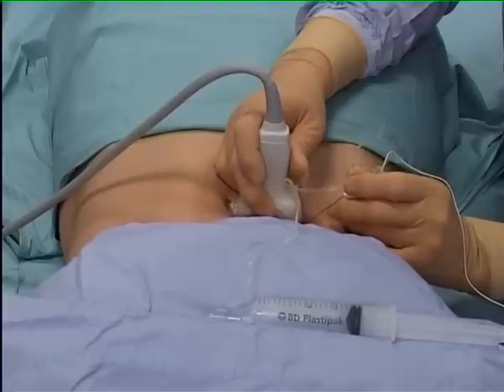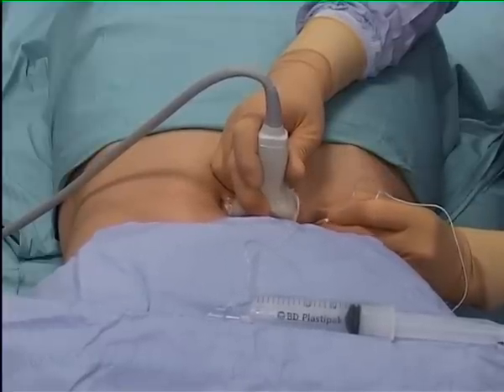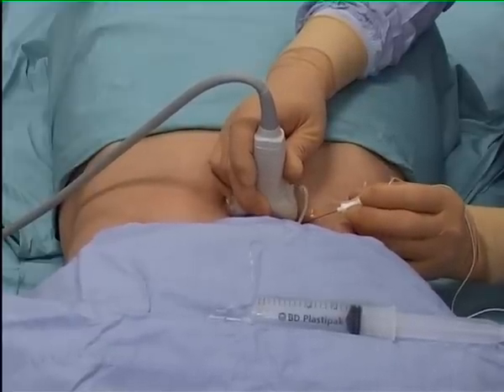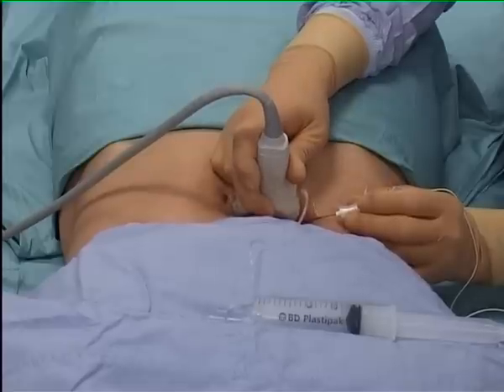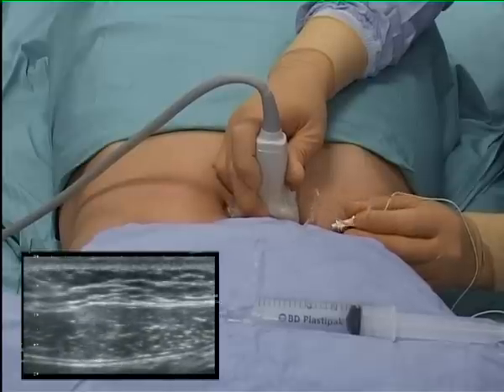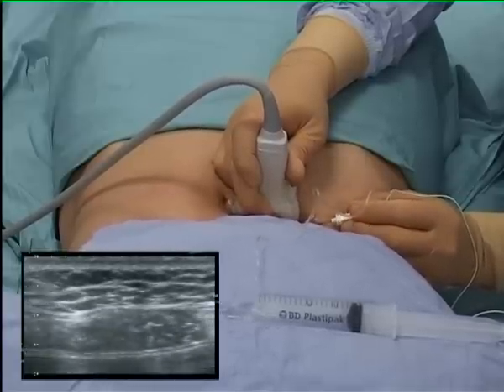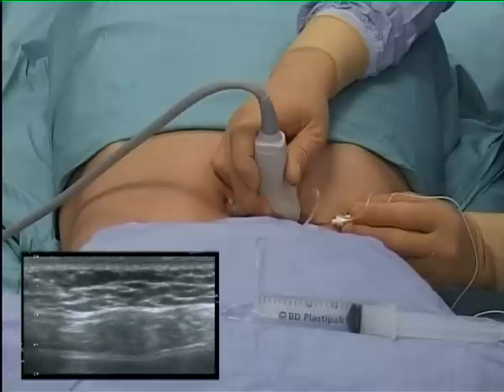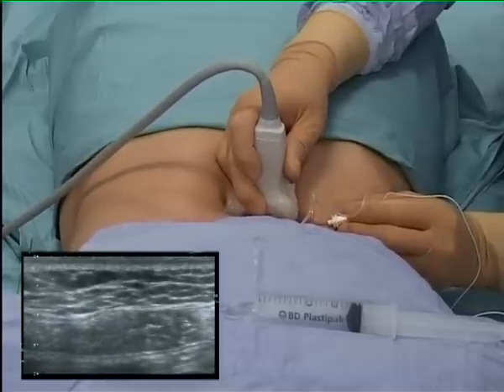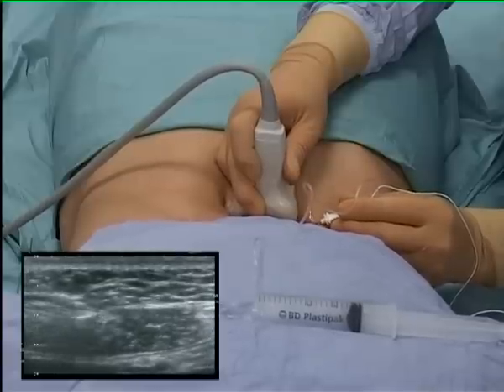Using the inline approach, the needle is inserted lateral to the probe. The trajectory is from lateral to medial. Note that the needle will appear from the left in this ultrasound image. Small probe adjustments are made to improve needle visibility. The needle is then advanced through the subcutaneous tissues, the anterior rectus sheath, and into the rectus muscle.